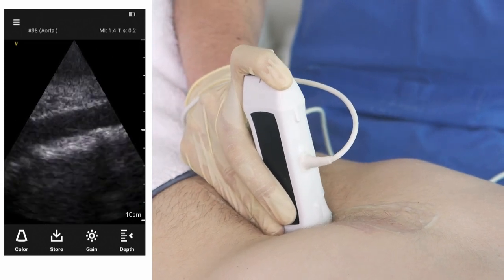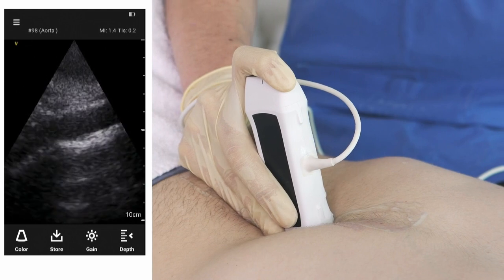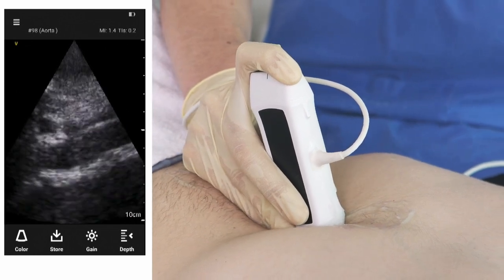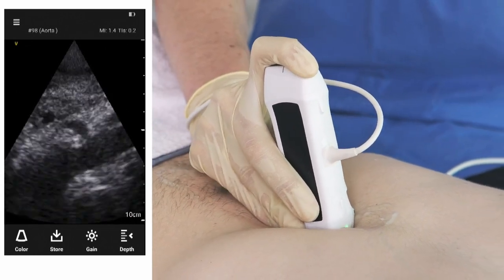One more time we move up cranially to assure that we haven't missed out anything important.